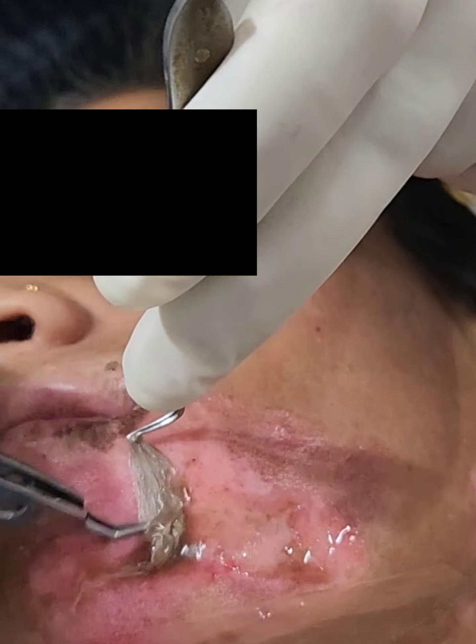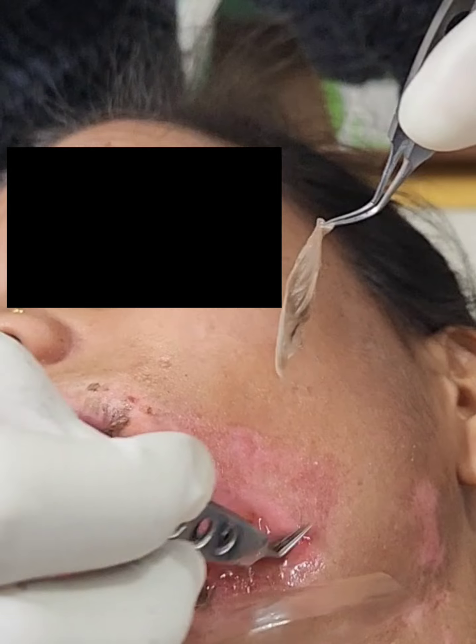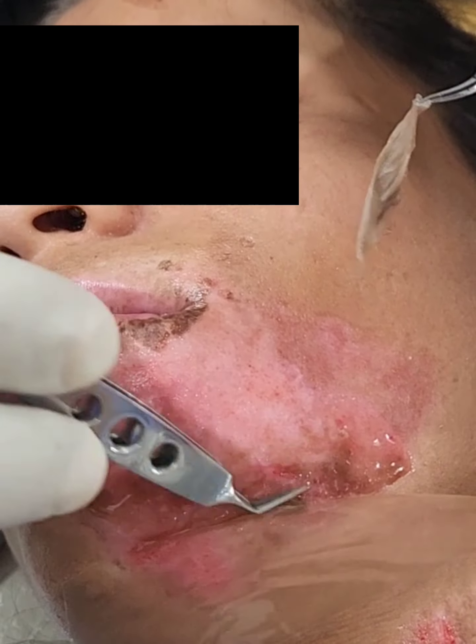The cells are not separated out in a Petri dish; rather, the cells are directly transplanted onto the recipient area. This prevents any loss of melanocytes.